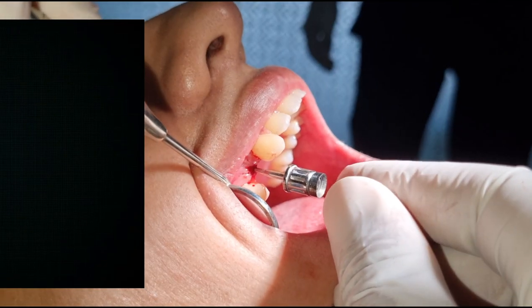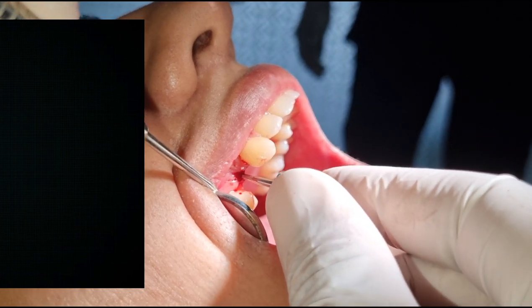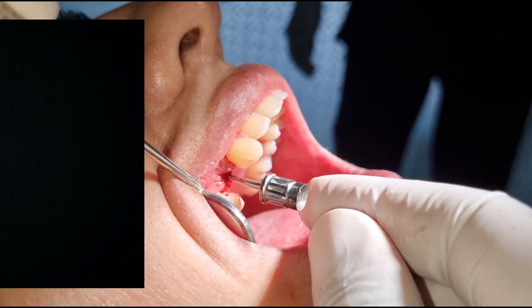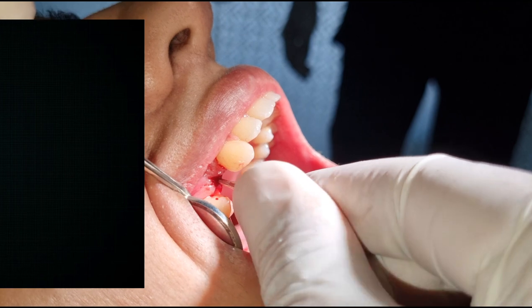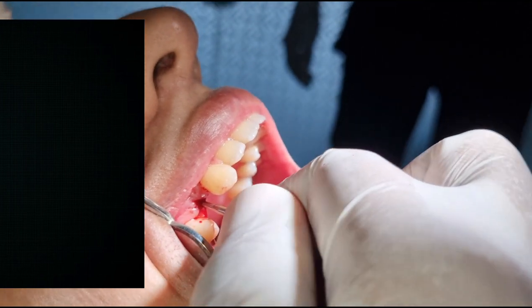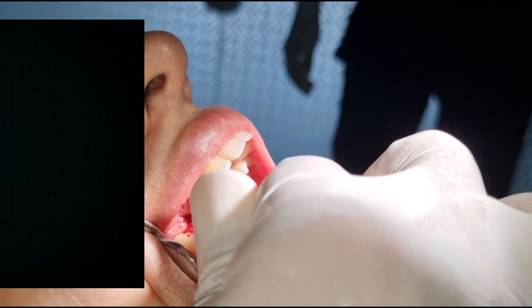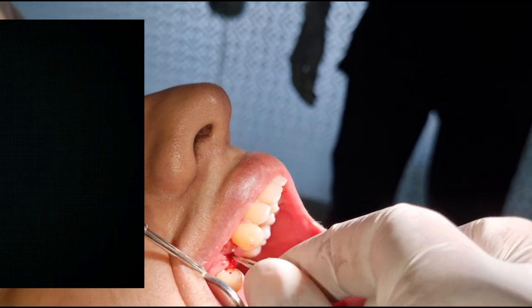After the implant has been exposed, you have to remove the healing screw so that the gingival former can be placed. I am going to use the implant key to remove the healing screw.